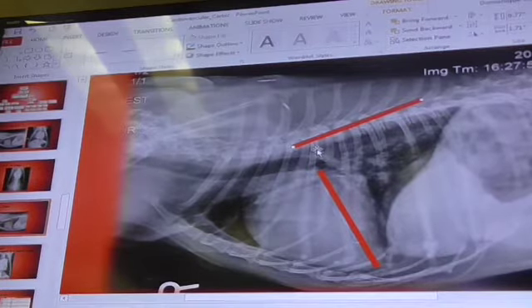Alright. So, long axis. You guys should have measured something like that. You start at the cranial margin of T4. Do I need to draw that line? So if this is T4, it's from here to here.